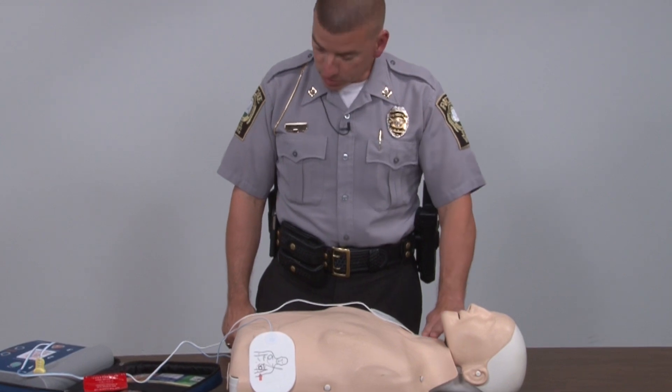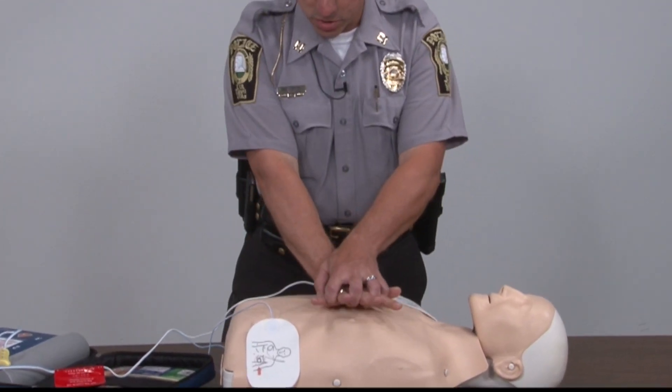Begin CPR. At this point I will check to make sure there's no pulse and start compressions again.